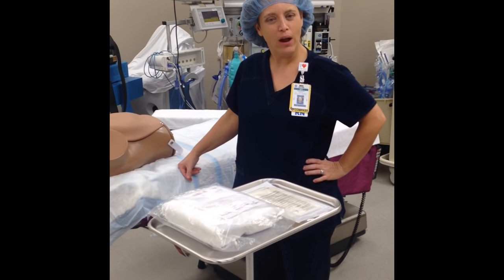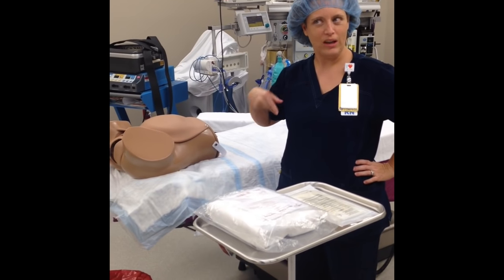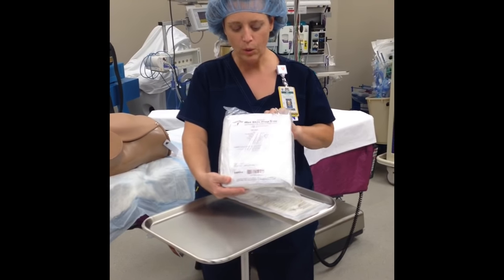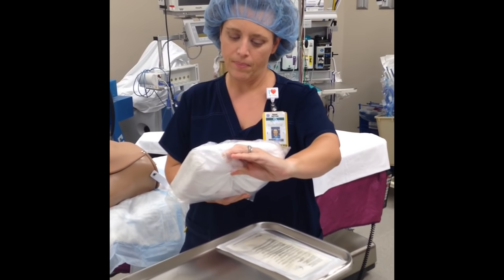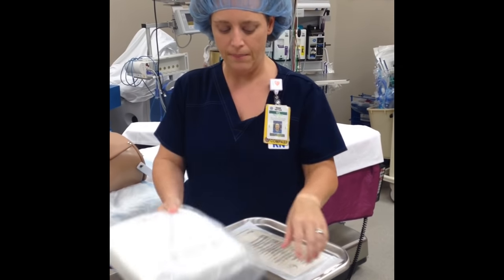Hello. Today I'm going to demonstrate for you how to prep a vaginal patient for a vaginal case. We will gather our supplies. We'll get a wet prep skin prep tray that has a Betadine iodine, so please make sure your patient does not have an allergy to that.